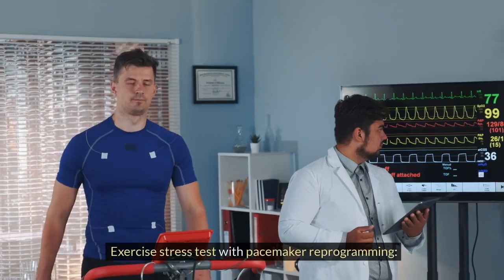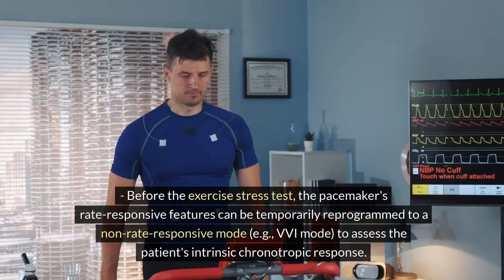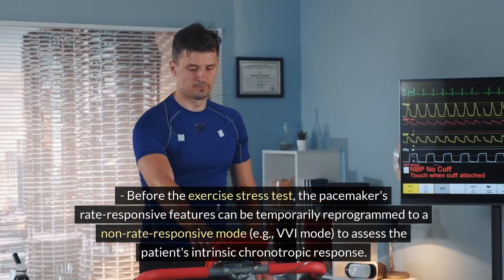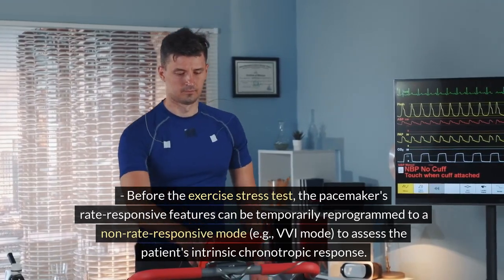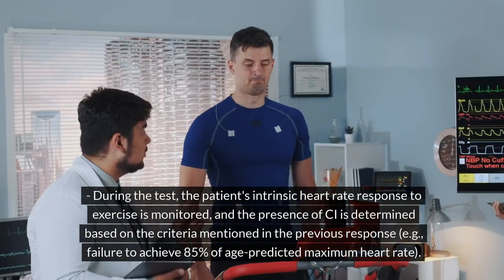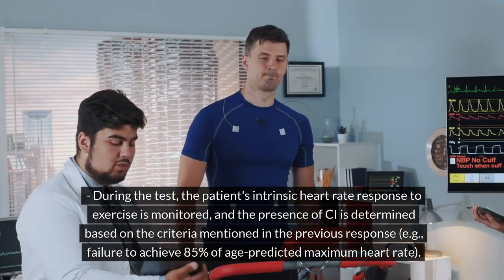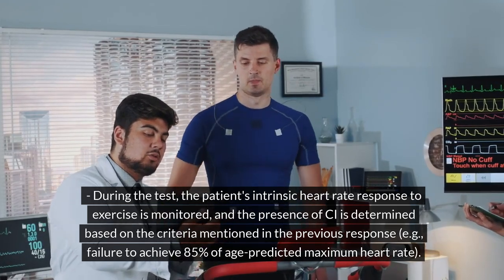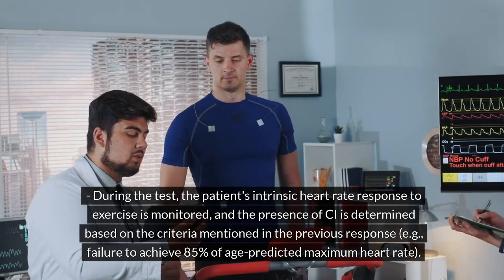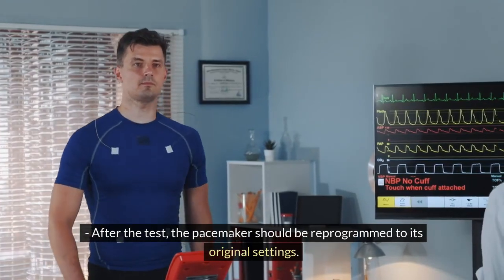2. Exercise stress test with pacemaker reprogramming. Before the exercise stress test, the pacemaker's rate-responsive features can be temporarily reprogrammed to a non-rate responsive mode, e.g., VVI mode, to assess the patient's intrinsic chronotropic response. During the test, the patient's intrinsic heart rate response to exercise is monitored, and the presence of CI is determined based on the criteria mentioned in the previous response, e.g., failure to achieve 85% of age-predicted maximum heart rate. After the test, the pacemaker should be reprogrammed to its original settings.